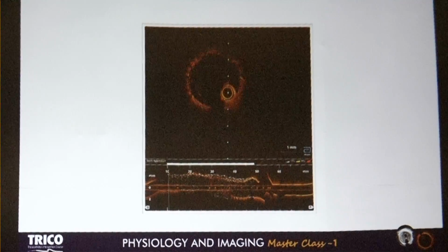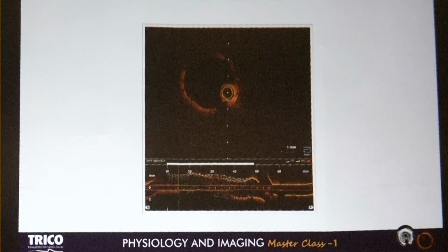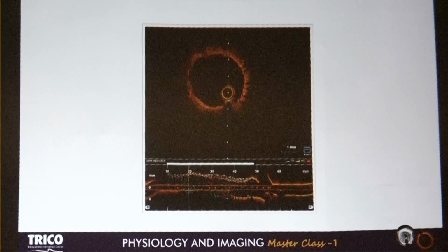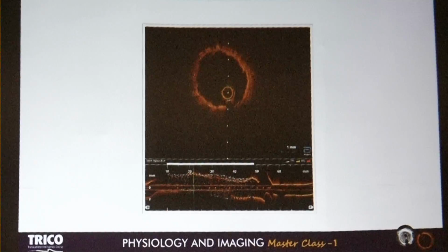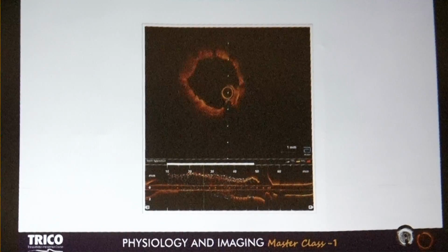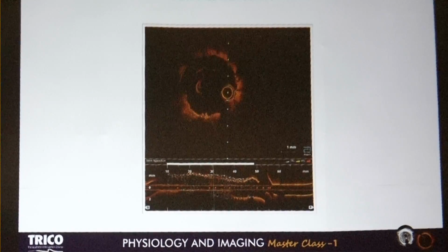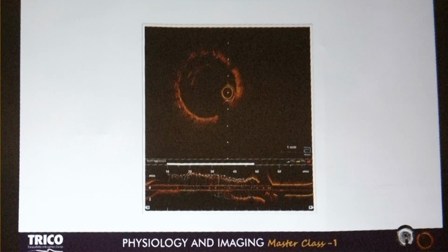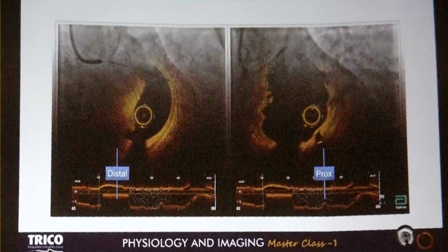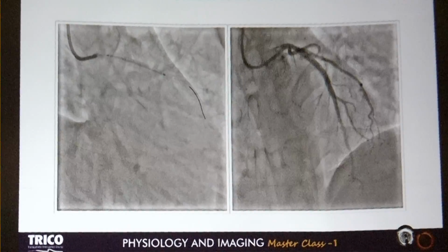So these are the cases where you come out with some very interesting observations with imaging, which can really modify your plan about final strategy. Was it an undersized stent in the proximal LAD, a nidus for the thrombus formation? See, we were all the time focusing on the problem, so I don't know that part.